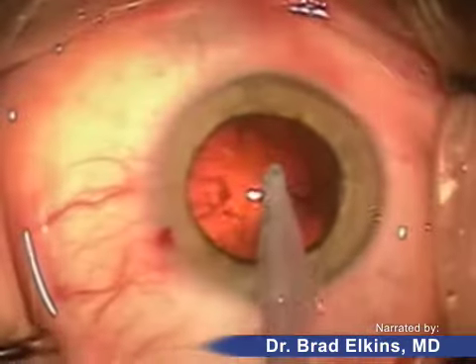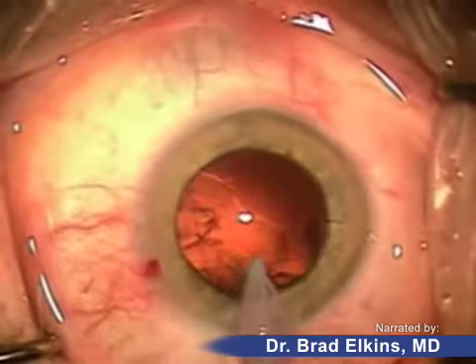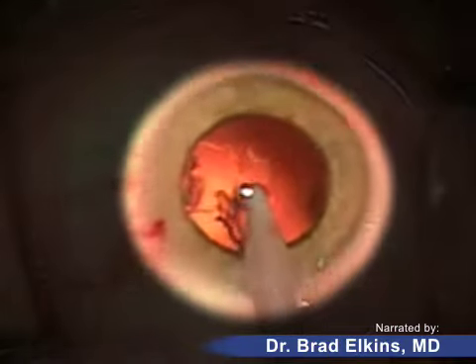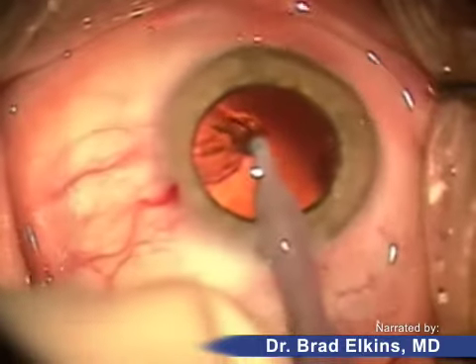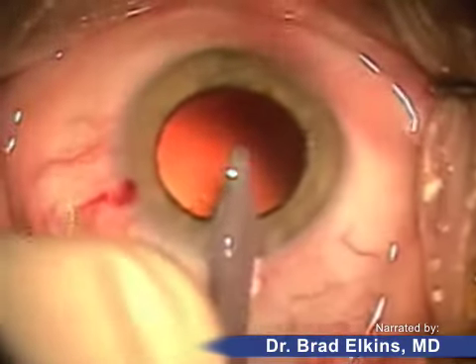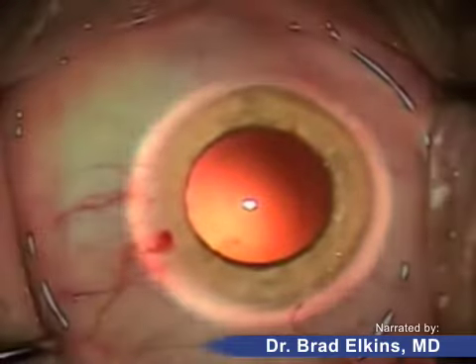The best way to describe a cataract is: if you took a water balloon filled with water and then froze it, the ice within that balloon is basically what's being removed during cataract surgery. We're leaving the water balloon intact except for the small circular hole in the front. As you can see, the ice has almost been completely removed while the water balloon remains in place. Now we can see the edges of this circular hole within the capsular bag.